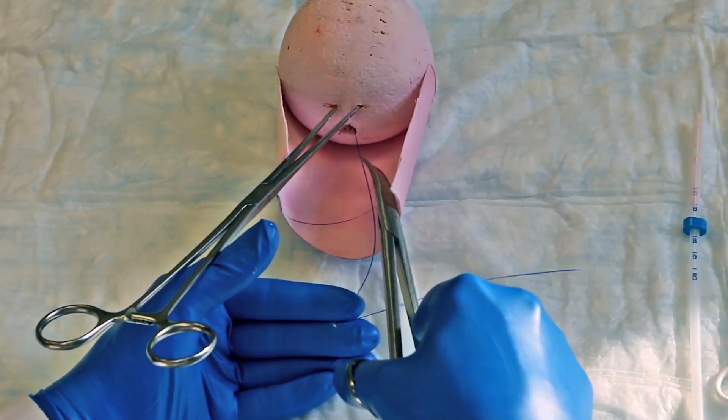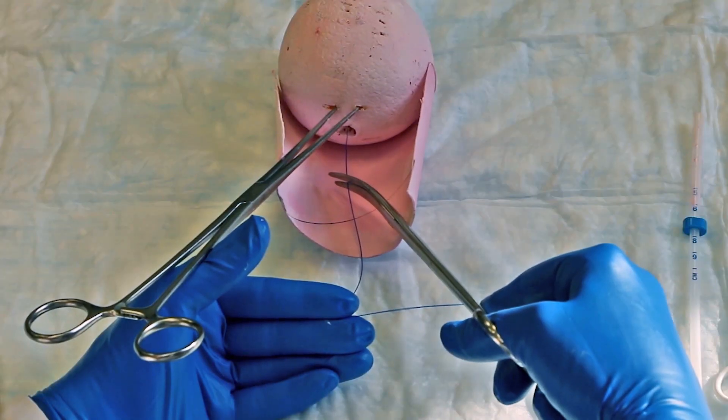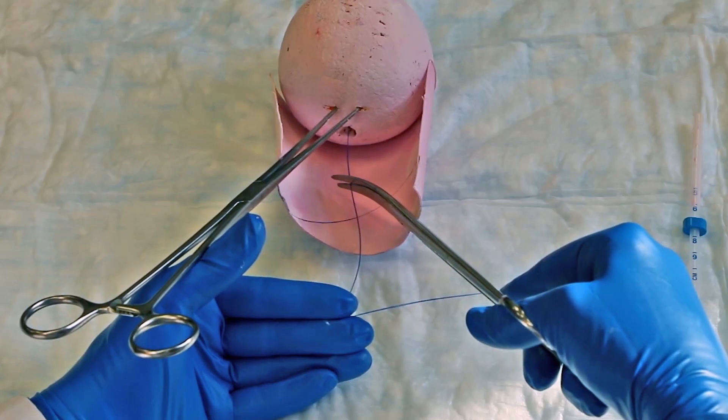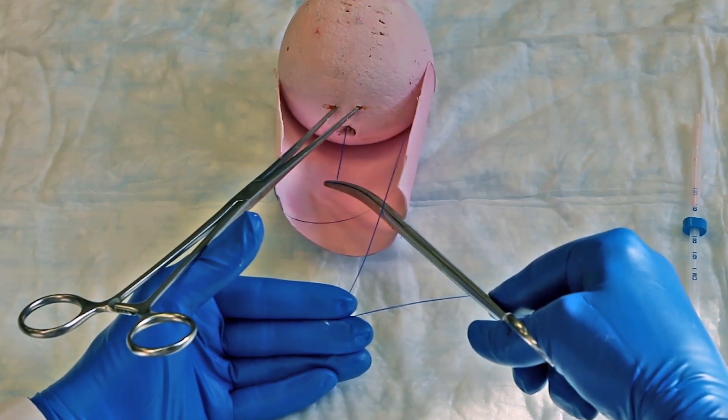Finally, trim the strings with scissors leaving 3 cm of string outside of the cervix. Take care not to pull the strings, or the IUD may become displaced.